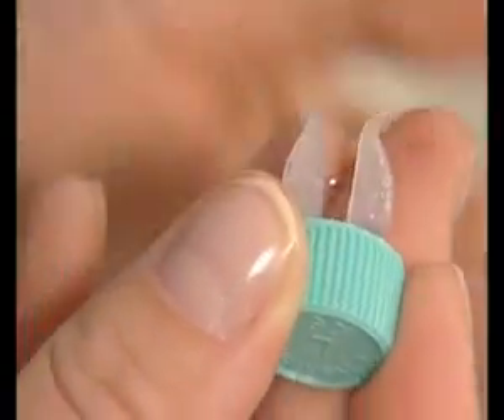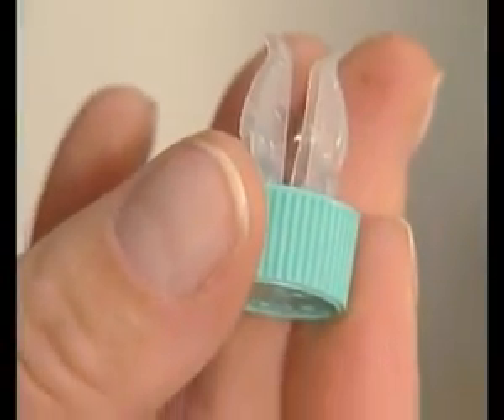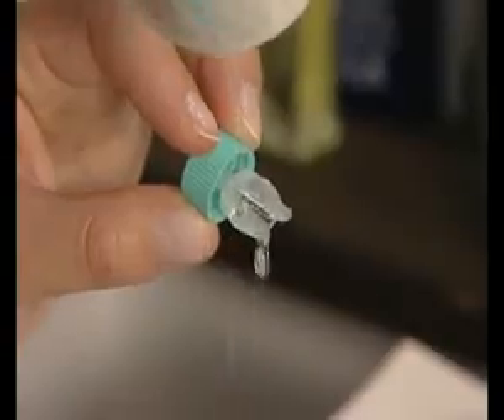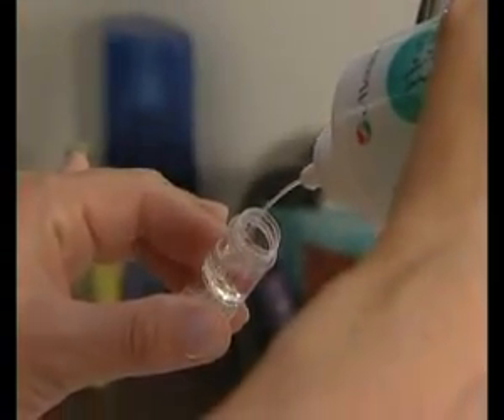If you experience any discomfort, it could be due to dust. Remove the lens and rinse it again. If the irritation persists, remove your lens and consult your eye care specialist.